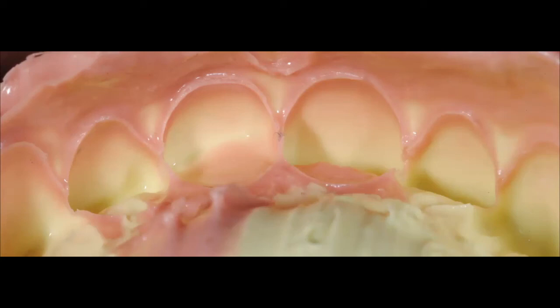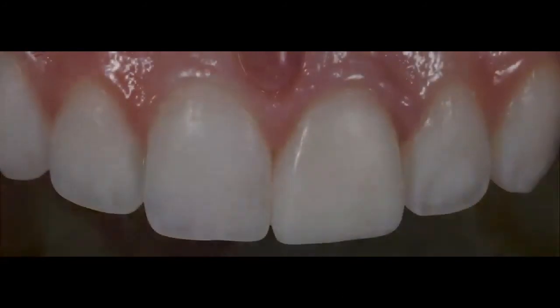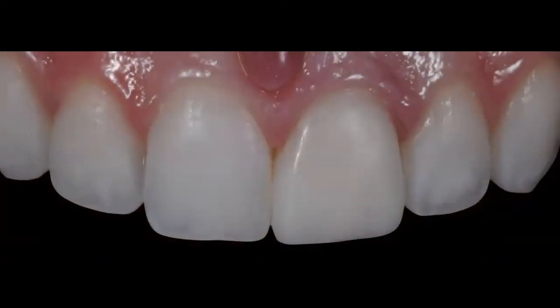Lab technicians that know how to use the material, these are really artists, and they're going to layer this restoration, and they're going to get the best natural effect within the restoration, because they're going to build everything in it. They're going to build the dentin, they're going to layer the dentin, they're going to layer your enamel, they're going to create your halo with the grays. So it takes a good technician that knows how to use this material. And it's not that easy to do, because you have to be very artistic with your hands. You have to understand how the combination of all these layers ends up in one final restoration. They are going to be able to mimic nature without any hesitation, if they know and understand these materials.